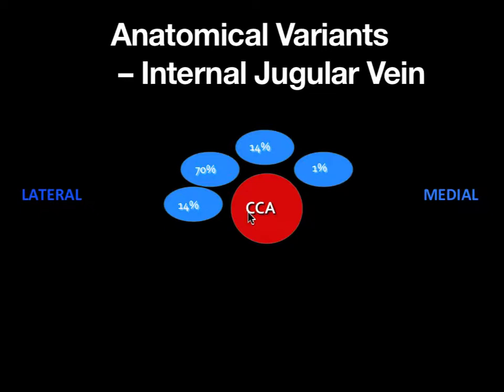However, ultrasound has given us the ability to dynamically look at these relationships, and a recent study showed that this relationship was only true in 7 out of 10 people. That means in 3 out of 10 people, this relationship is not going to be true. So you could see how you could get yourself into trouble or have technical difficulties when performing a surface landmark approach.